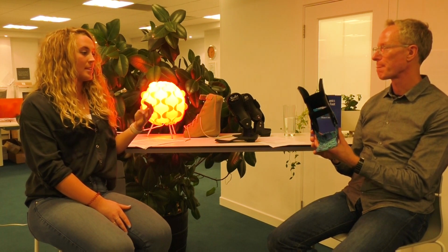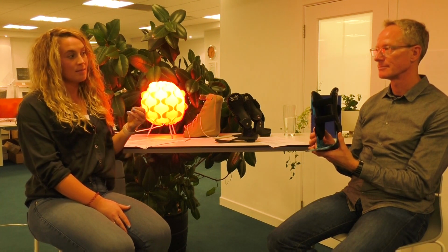And Doug said the last day, look, even if you do cast them and they use it and it doesn't work and they have to get the surgery, it can always be used post-surgery to help getting them back on their feet. So it can be part of the treatment plan from either side.